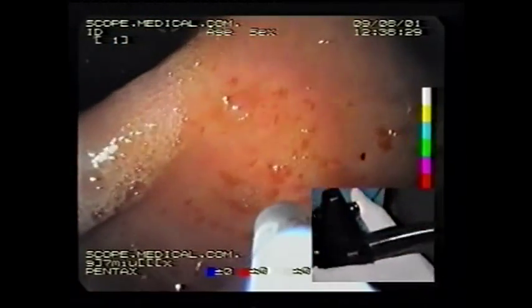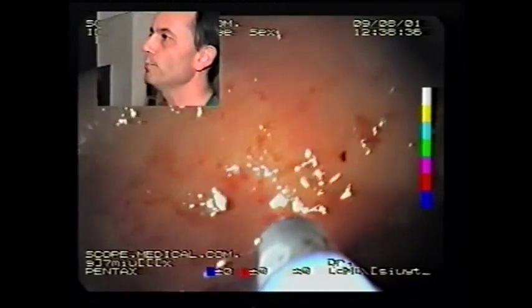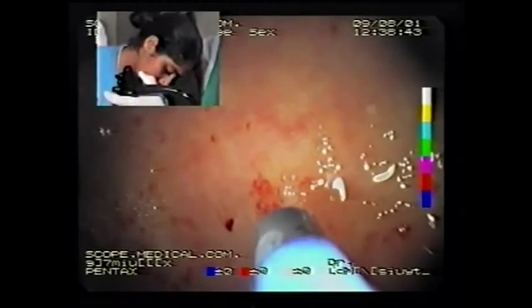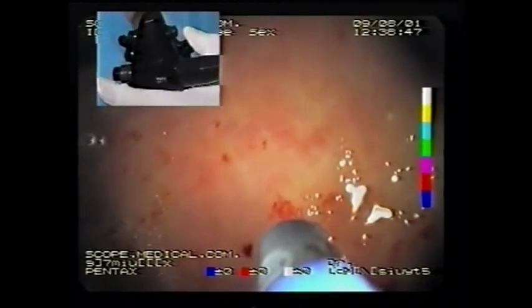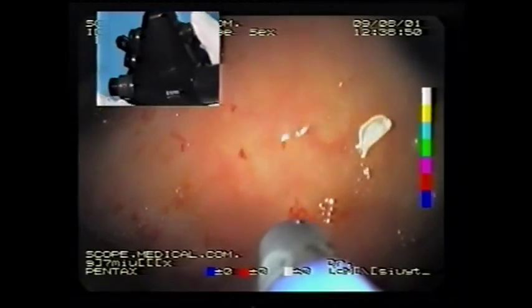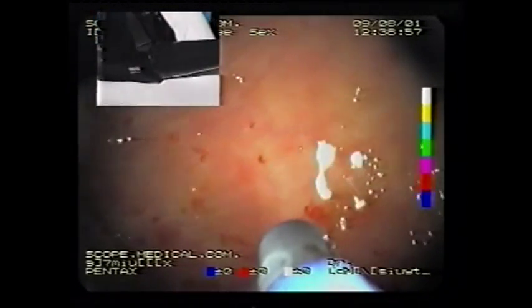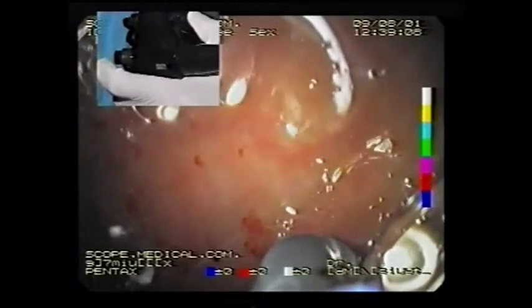I think it's a good indication for APC, and therefore the patient now has the neutral electrode on his leg. What I do, and I prefer, is to have the probe just a little bit outside of the endoscope, so that I have a better option for targeting lesions. I want to avoid direct contact, because this may cause occlusion of the probe. We have a flow rate of 2 liters, which can be inconvenient for the patient. So if you treat patients for a longer time, you can also insert a gastric probe to reduce the amount of air.